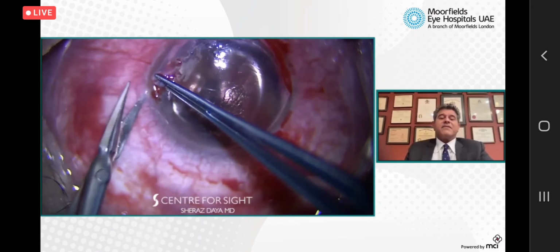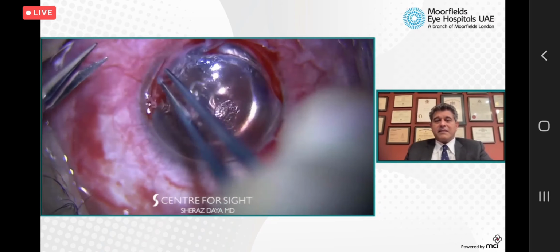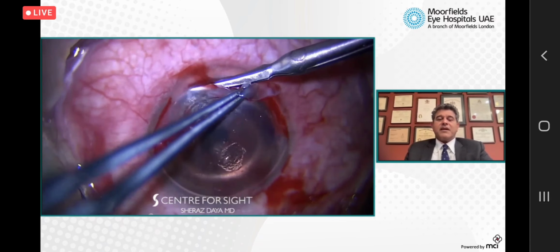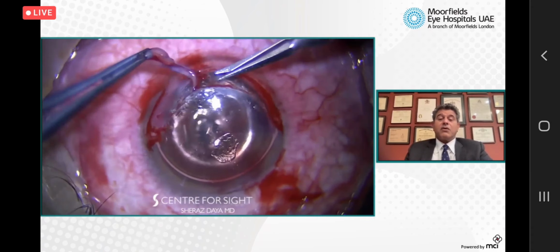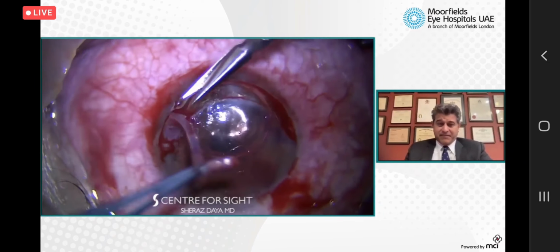And you can see that the periphery didn't cut very well with the femtosecond laser, but I can see the outline, and that's what I'm using as a guide to remove the tissue. And again, on the other side, now I'm going to the area. You can see that bubble just suddenly disappeared there a little bit, and you will see it go completely now. So there's a hole there where they had the pellucid. As I say, I'm not too bothered by it.